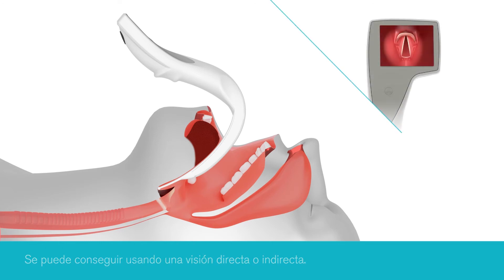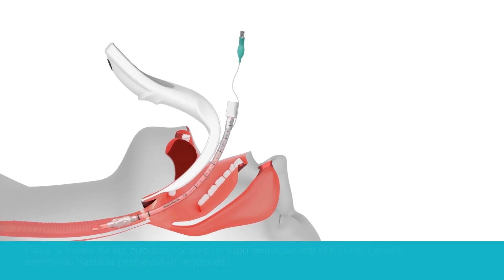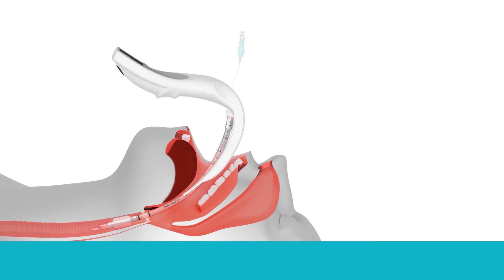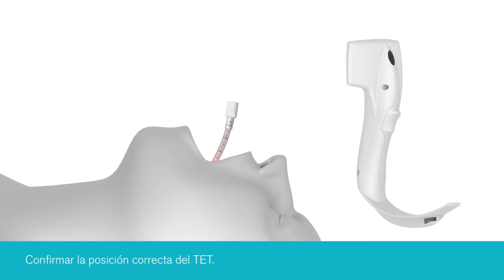Once the glottis has been identified, an appropriately sized tracheal tube can be passed through the vocal cords to the required depth, and the iView gently removed. Confirmation of correct placement of the tracheal tube should be assessed by the use of waveform capnography and other methods in accordance with applicable guidelines.